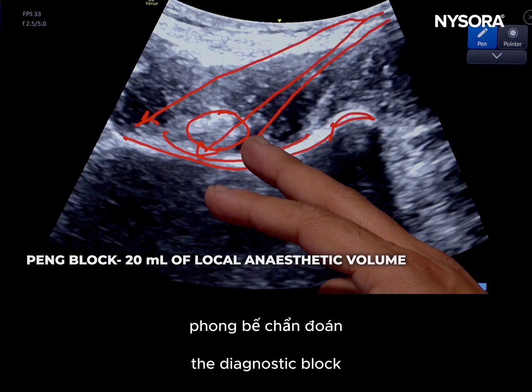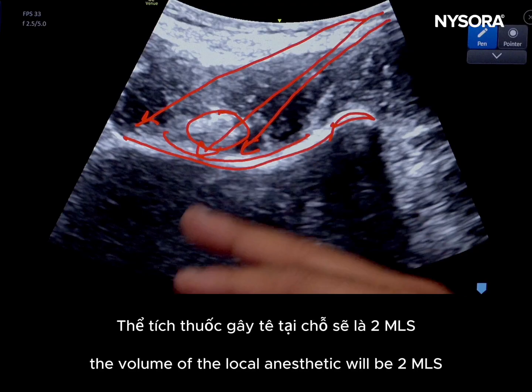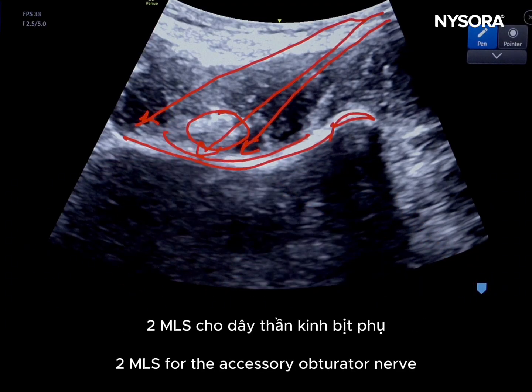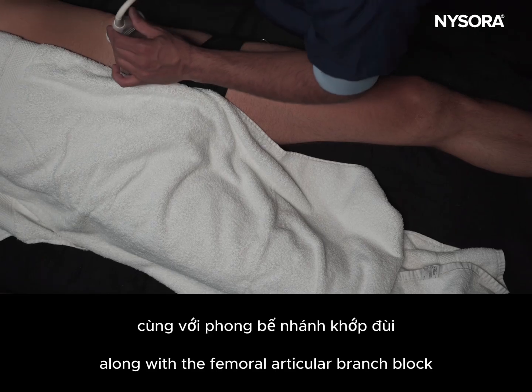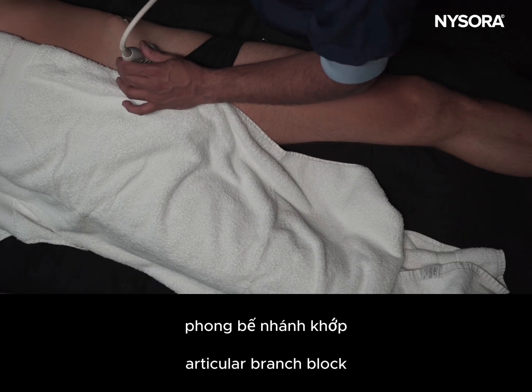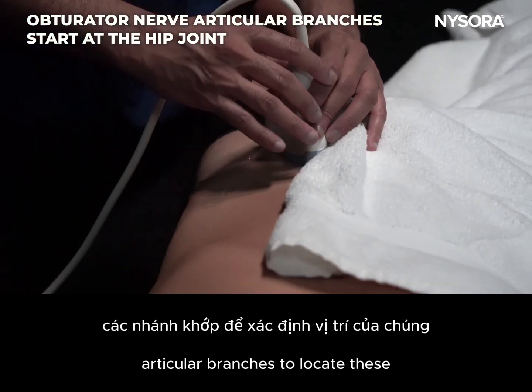To perform the diagnostic block, the volume of the local anesthetic will be 2 ml for the femoral articular branches, 2 ml for the accessory obturator nerve. So this is the PENG block along with the femoral articular branch block and the accessory obturator nerve articular branch block. We are going to move on to the obturator nerve articular branches.